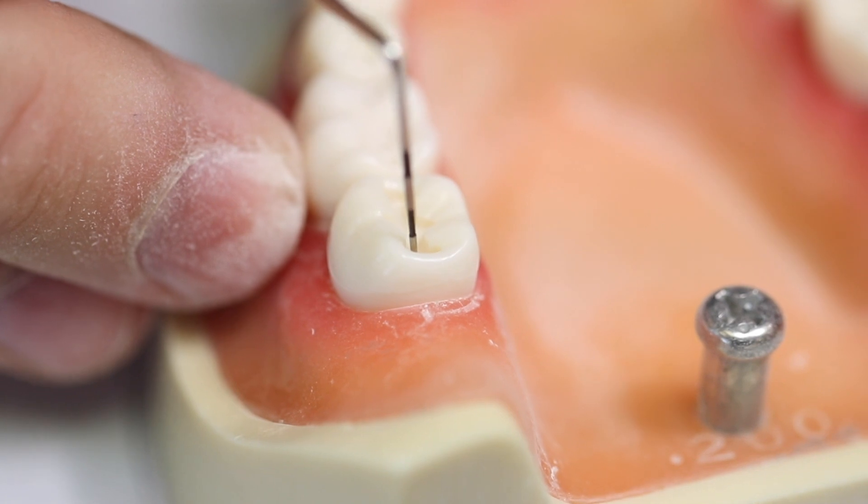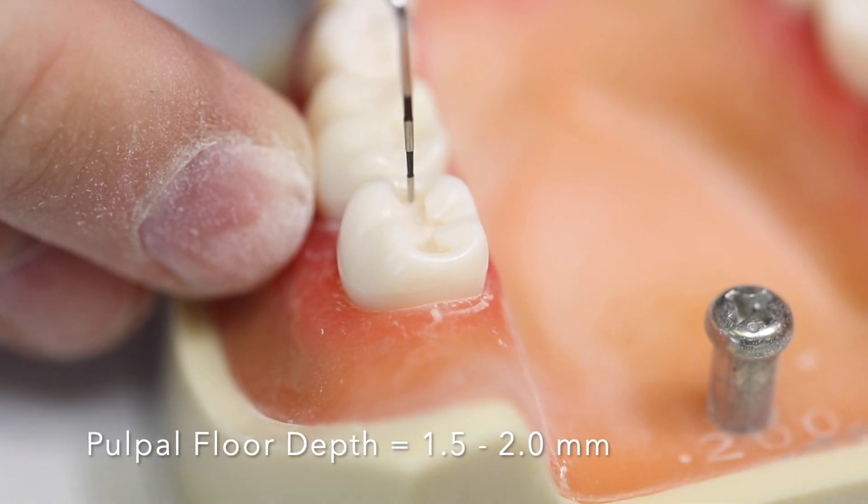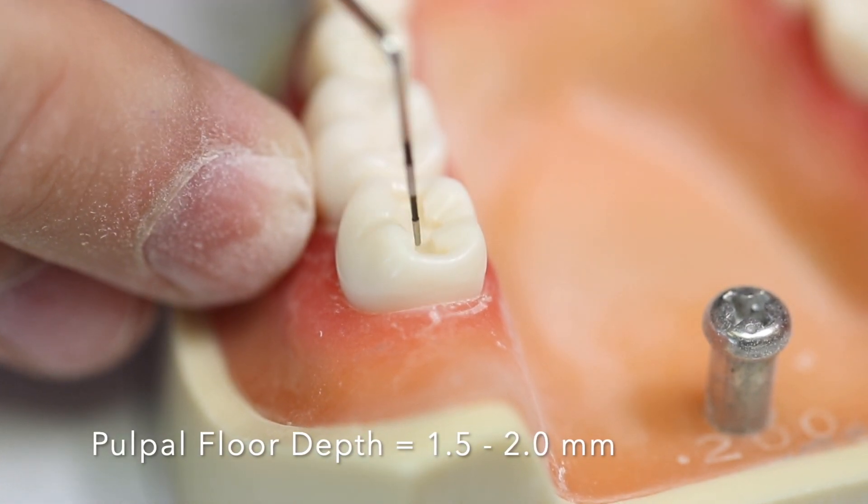The pulpal floor measurement should be 1.5 to 2.0 millimeters from the occlusal surface to the pulpal floor depth.